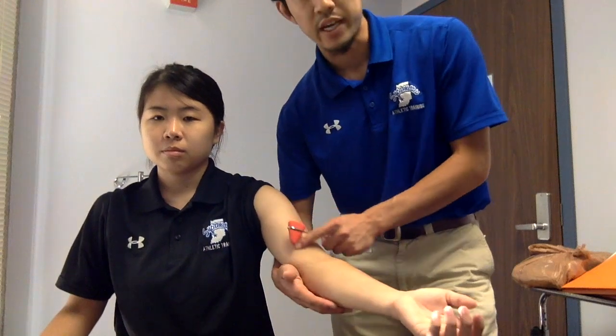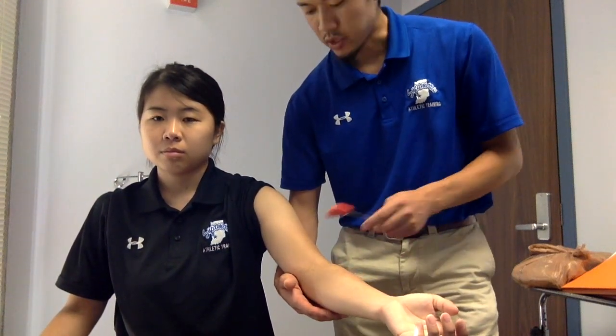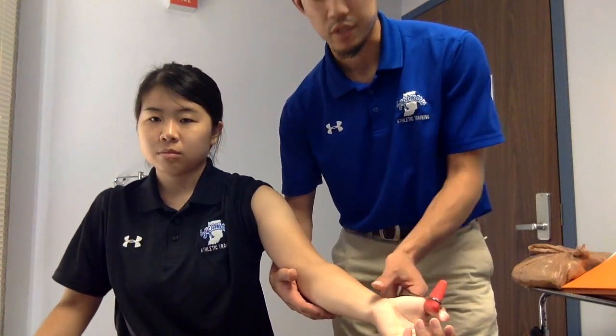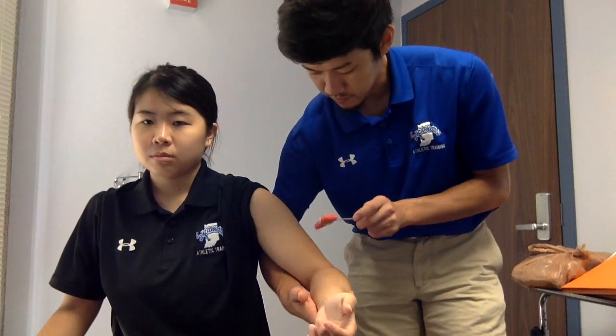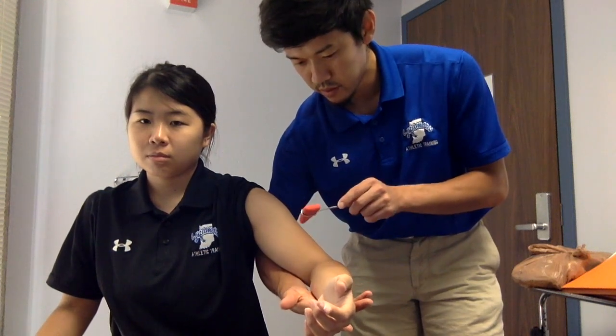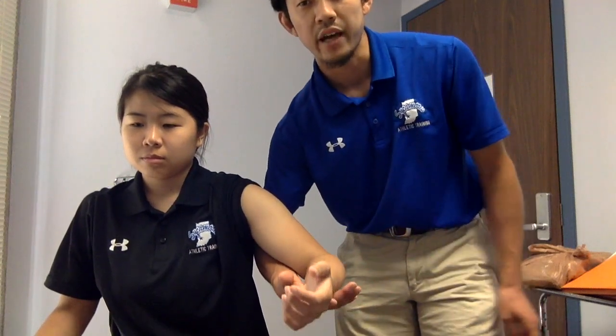For the C5 test, you will use the biceps brachii tendon, which lies on the anterior side of the elbow. By using a reflex hammer, you will hit the anterior side of the elbow, which is called the cubital fossa. Make sure the patient is relaxed, then hold the patient's forearm and hit the hammer to the anterior side of the elbow. For a normal reaction, you will see slight elbow flexion.